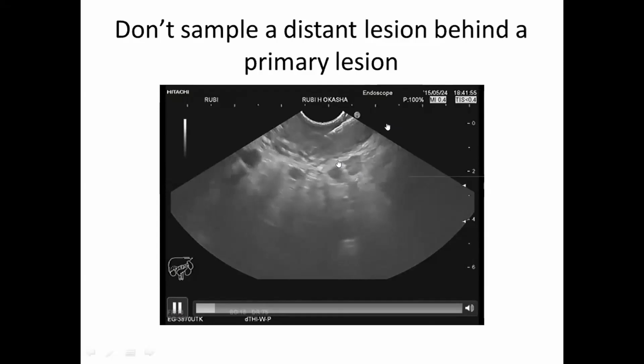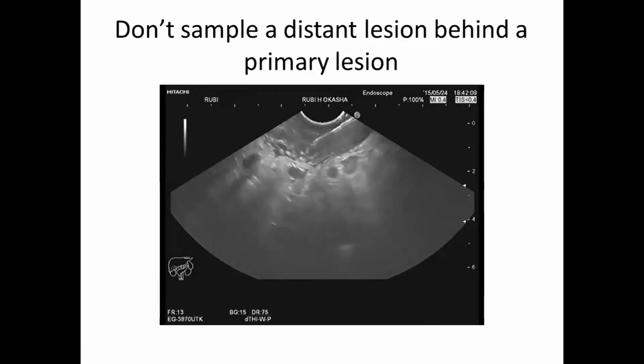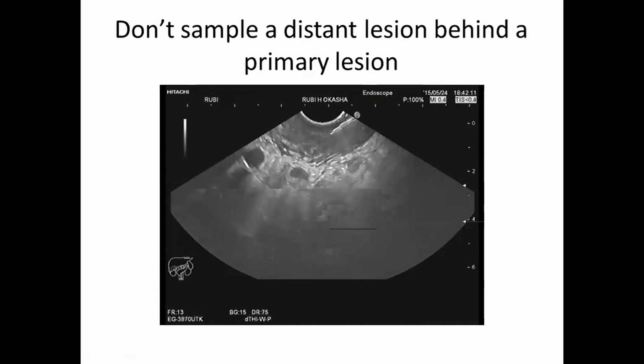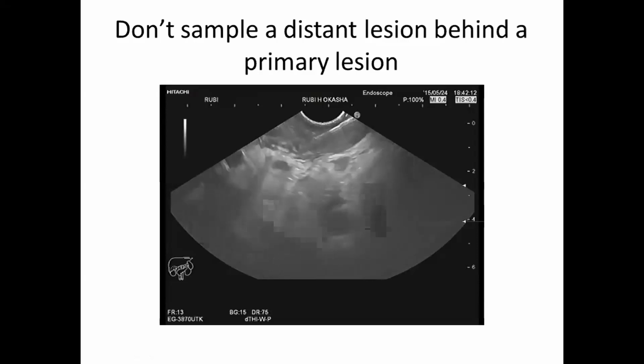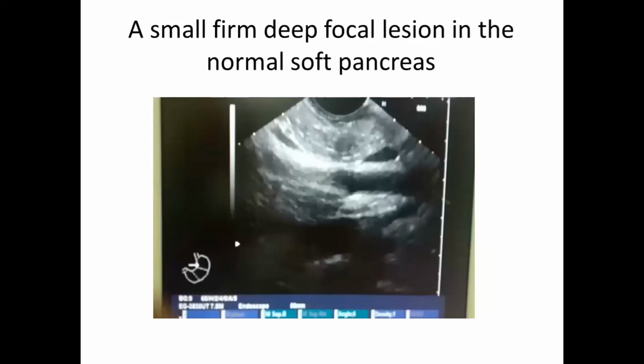So I sampled only the wall, and this is enough for diagnosis, and I didn't sample this lymph node because I shouldn't traverse a primary lesion to reach a distant lymph node. This is a very nice case which I'd like to share with you.